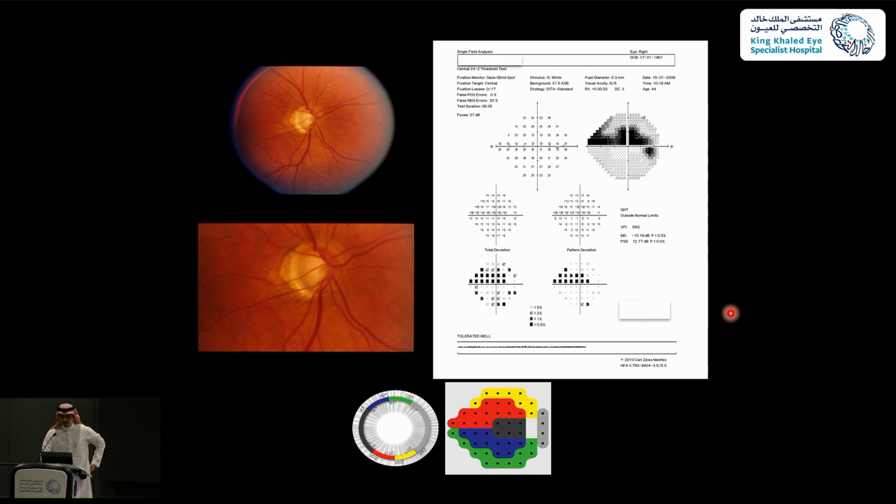That's another visual field printout of a patient who has significant glaucomatous visual field damage. Again, you need to apply the same principle. So we'll go for the W, what was done. What was done here is a 24-2 SITA Standard. Patient reliability indices should be reviewed again. Fixation loss, false positive and false negative should be less than 20%. With advanced disease, you can accept 30%.